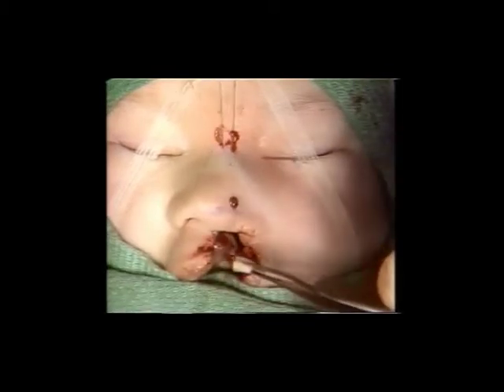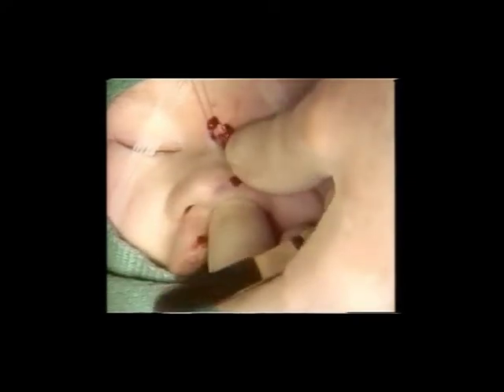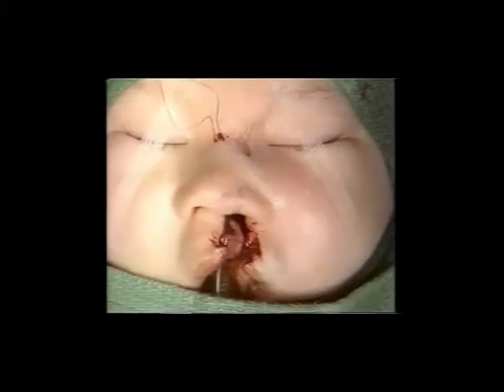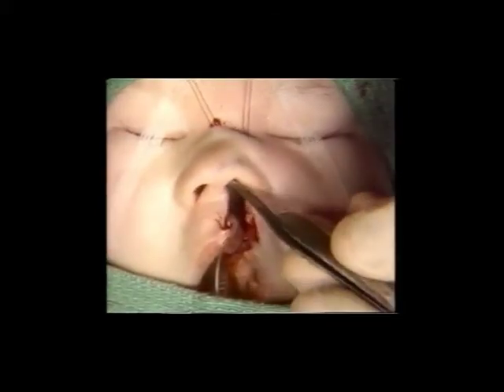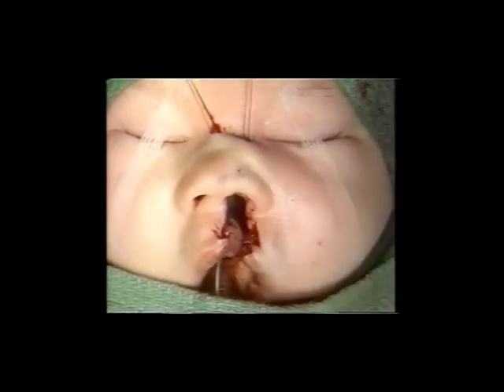As this suture is pulled up, a bolster is placed over its loop. The two ends are then used to pull the dome cartilage superiorly. A second such suture is placed further lateral to show the advancement of the cartilage into normal position.